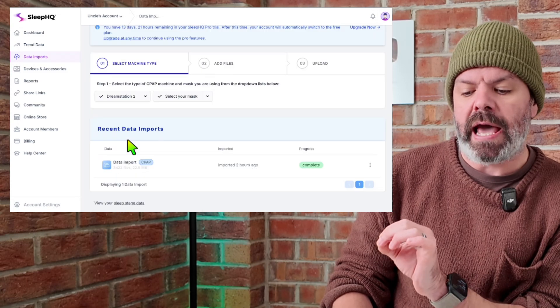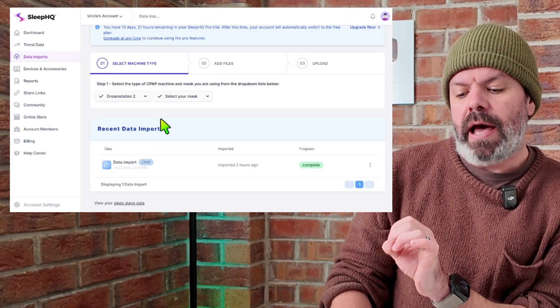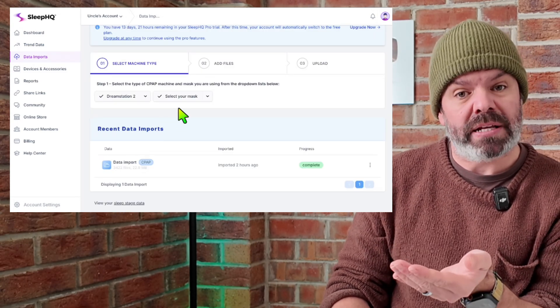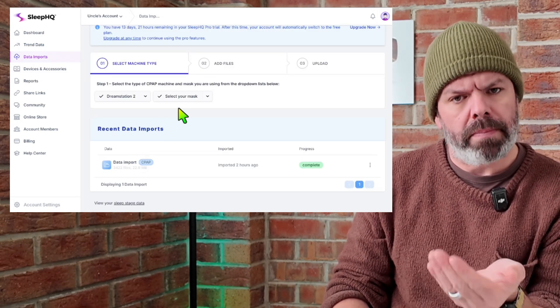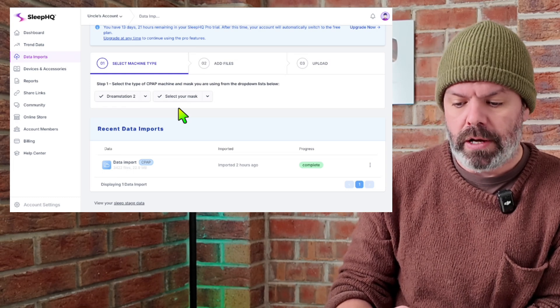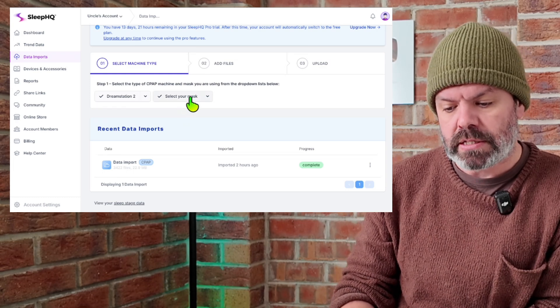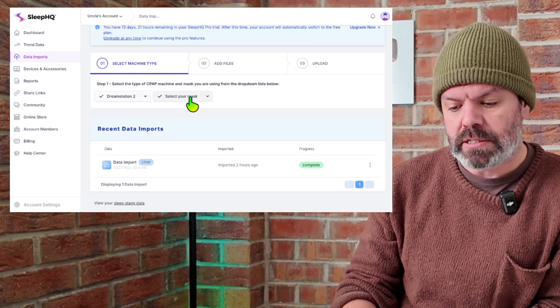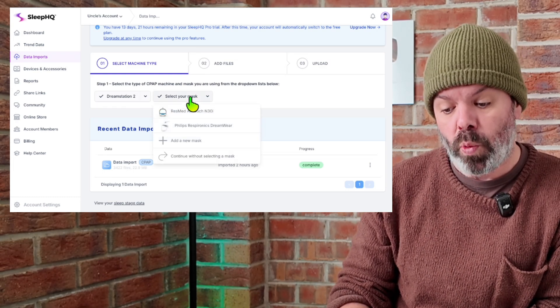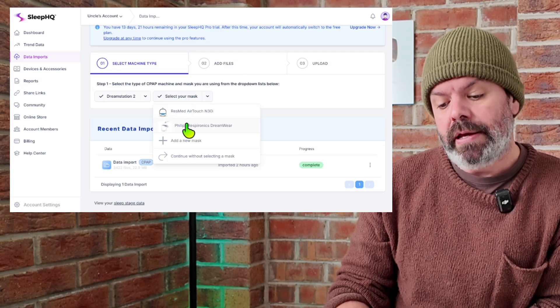And we've recently added a section where you can select your mask now if you want to track your mask performance. So I'll click select your mask and we'll choose the Philips DreamWare here.